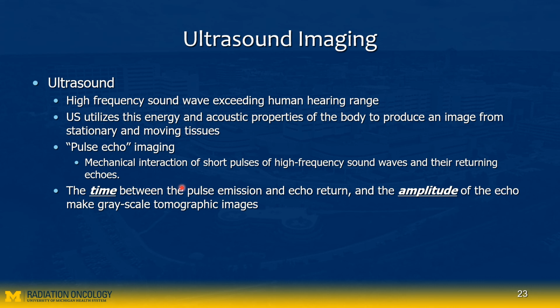Ultrasound, as the name implies, is high frequency sound wave. You cannot really hear it because it exceeds our hearing range.